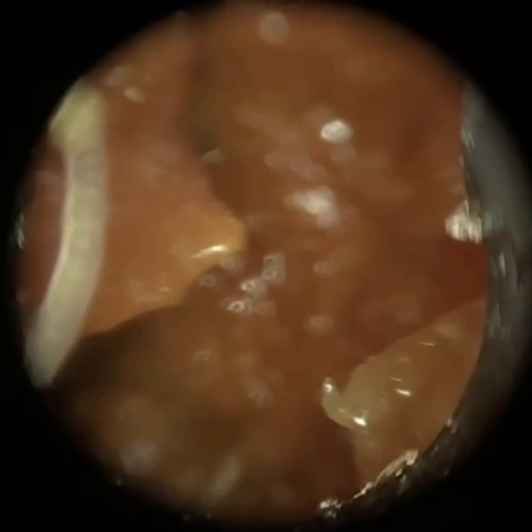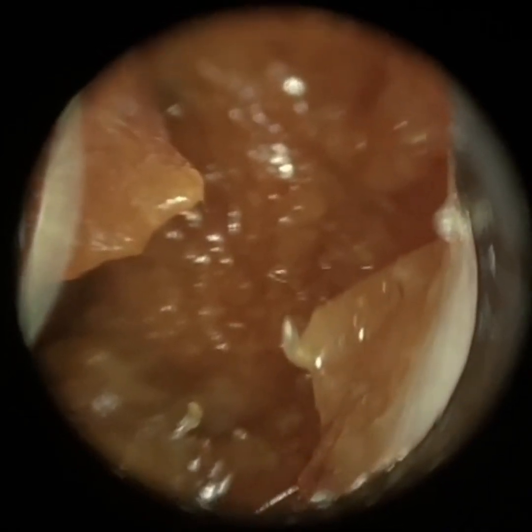Hi everyone, this is Neil Reiteter, consultant audiologist and director of Clearwax. Thank you for joining me in this latest video, which demonstrates the use of the Waxscope.